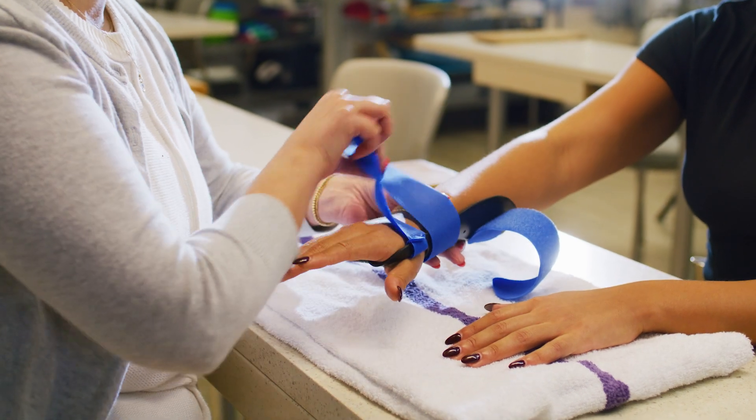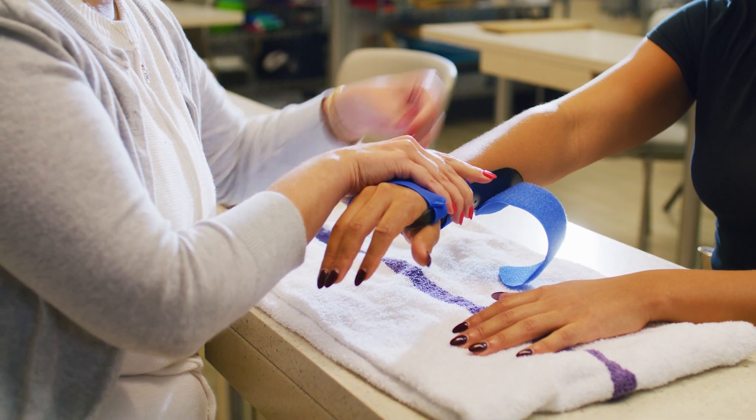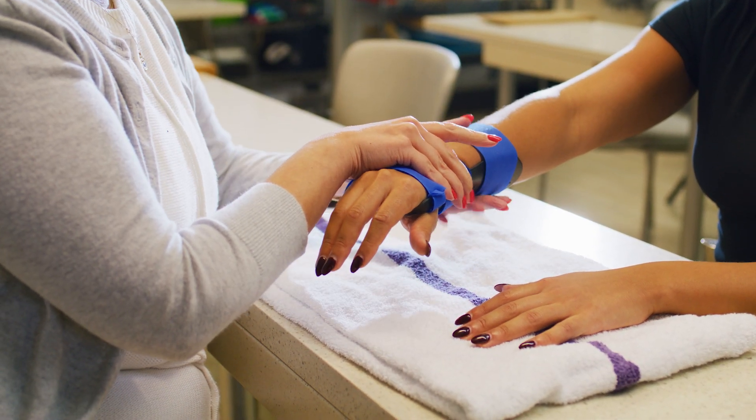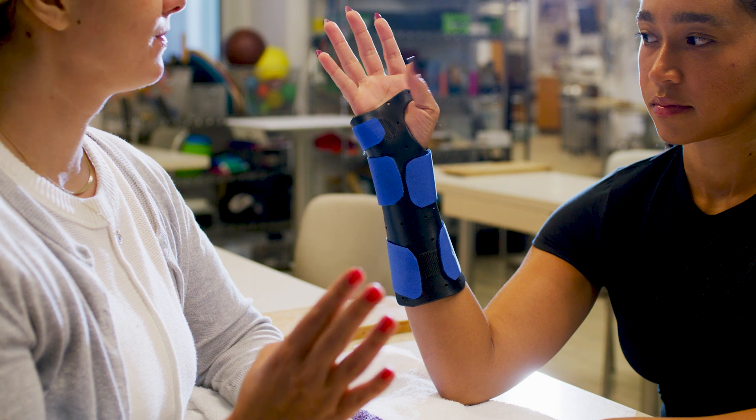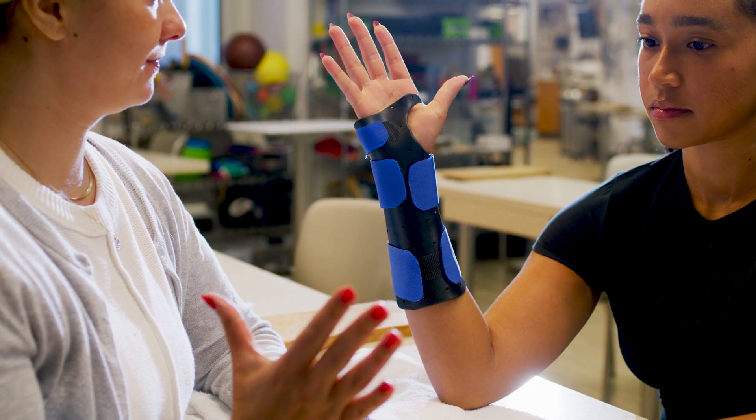A splint is not circumferential, meaning that the hard parts of the splint do not fully wrap around the limb and is attached by an ACE wrap, while a cast surrounds the injured body part. Splints are often used when there is a great deal of swelling because they can be loosened or tightened as needed.